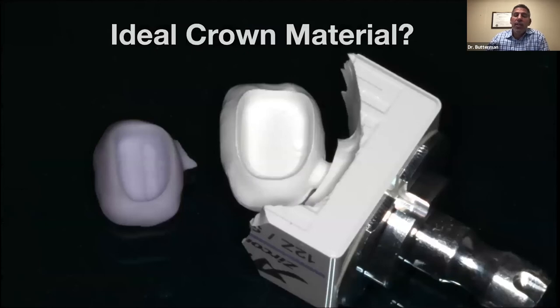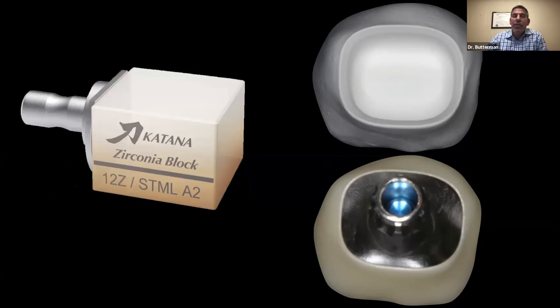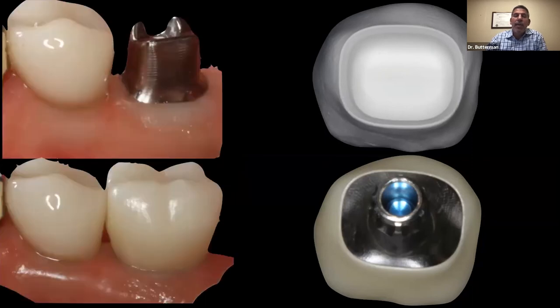So you can kind of see, this is the same restoration. Obviously, I haven't sintered the zirconia crown, so it looks much bigger, but it's actually the same restoration. You can see all of that overmilling that's going on the Emax one, and none of it is going on the zirconia. Just another one. This is a Celtra Duo crown. Look at all that overmilling that's happening, and it's perfectly smooth because we've got that 10 finisher, those small diameter burs. The margins are just going to be insanely good with that. So Katana is kind of my go-to for that.